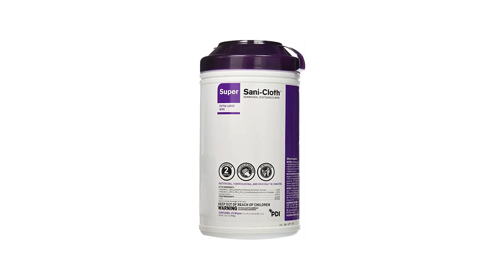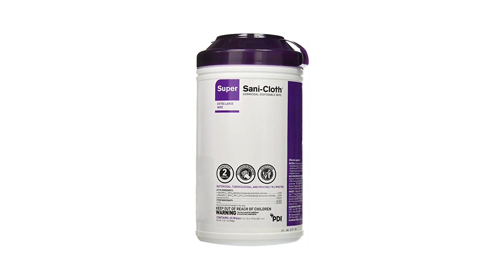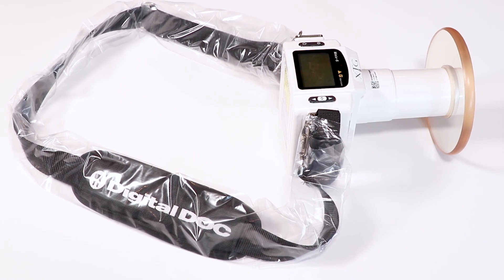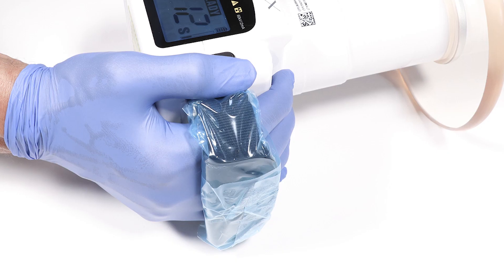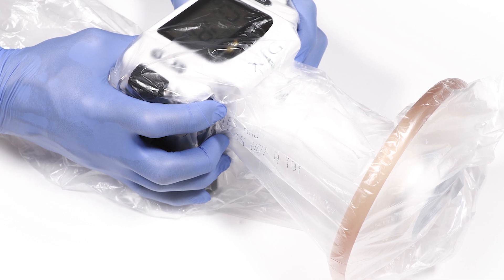Disinfecting XTG: you can wipe this unit down with a non-alcohol wipe such as a Sani-Cloth. You can use a sheath to cover the strap, blue tape for the side strap, or a bag to cover the entire unit.